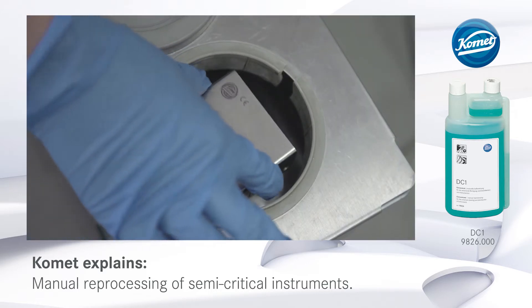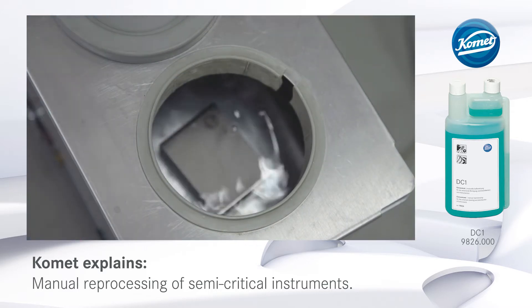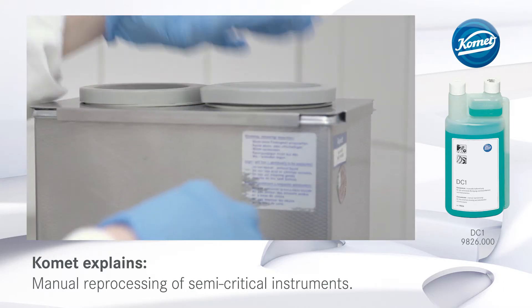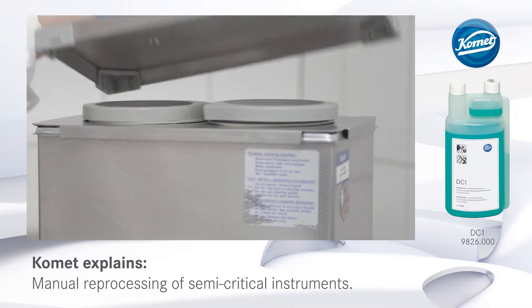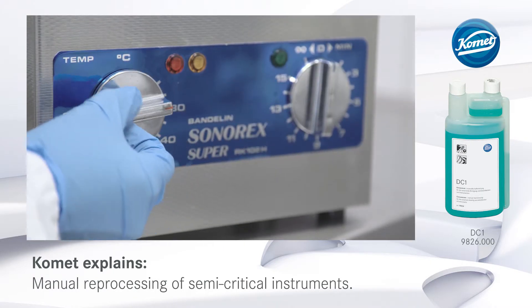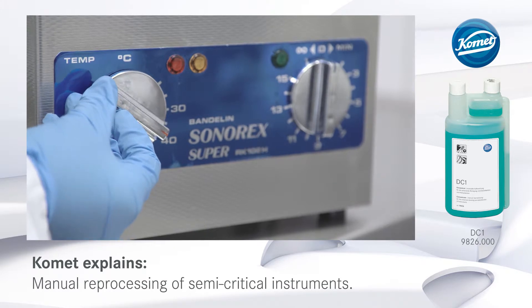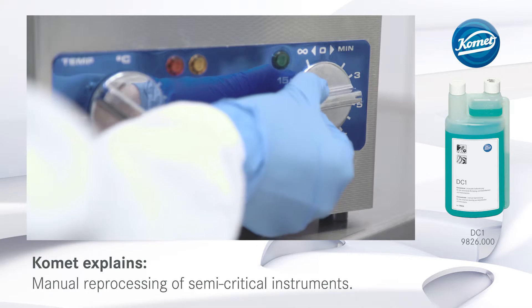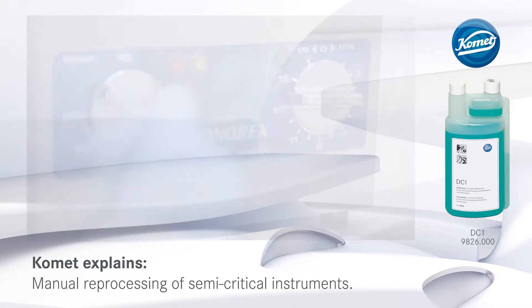To prevent possible damage, do not allow the burr block to come into contact with any other instruments inside the bath. The instructions provided by the manufacturer have to be strictly observed during ultrasonic cleaning. Do not allow the temperature of the bath to exceed 45 degrees Celsius because this might cause protein coagulation on the instruments.